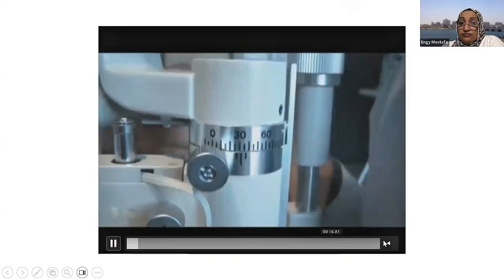Some of our friends ask a question for you, Dr. Engy. Are you using only fluorescein or different coloring in the different situations? Actually, we are using fluorescein dye only. The rose bengal has a very stinging effect on the patient, and most of our patients are dry eye patients, so they are already overstimulated.